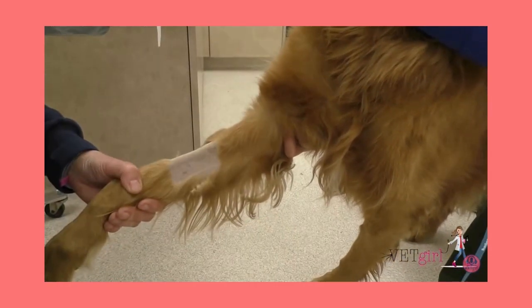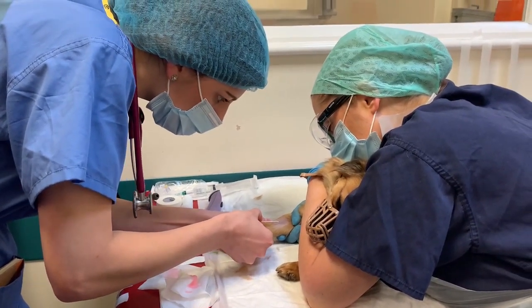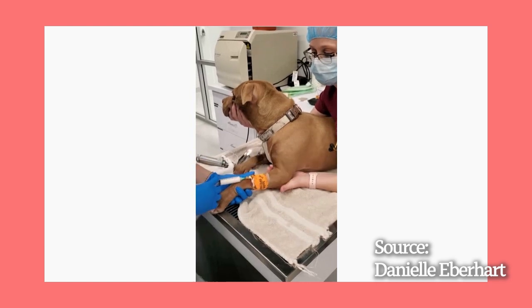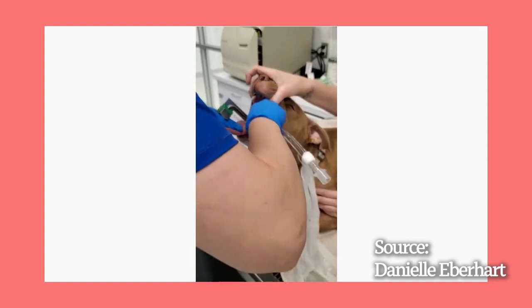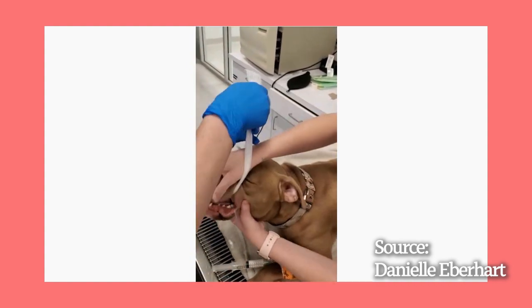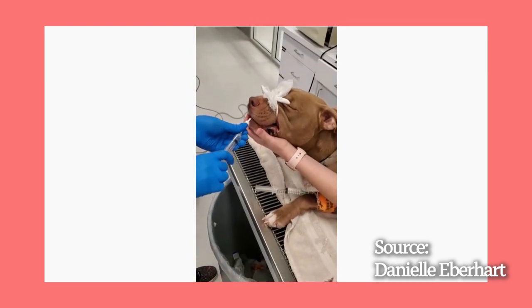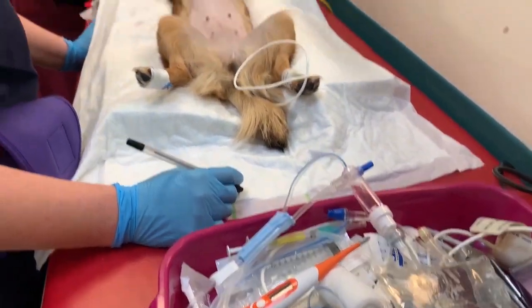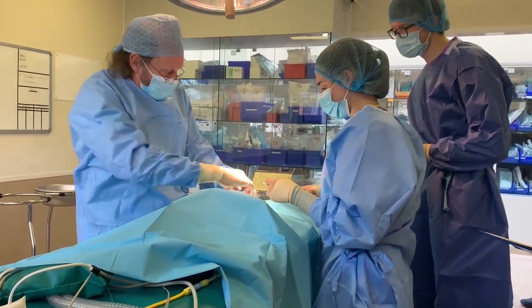For a detailed video on the pre-operative stuff that we do, I've linked these amazing informative videos below. This video shows how we induce the dog using an induction drug and then intubate the dog with a laryngoscope and a tube, so that we can have a patent airway for the oxygen and the anesthetic agent to be administered to the dog. So after inducing our patient, we roll her into theatre and connect her to the monitoring equipment. Then the surgeons can begin the procedure.